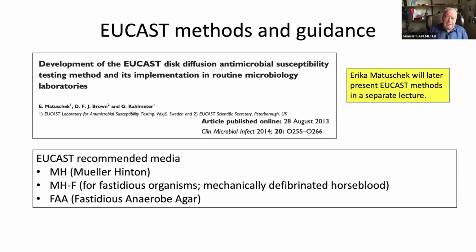There are lots of publications out there on everything from methodology, to breakpoints, to rapid AST directly from blood culture bottles, which is a whole section on its own. And if you're into bloodstream infections and rapid diagnostics, then I urge you to go to the EUCAST website and read the EUCAST rapid AST directly from positive blood culture bottles. It works really nicely.